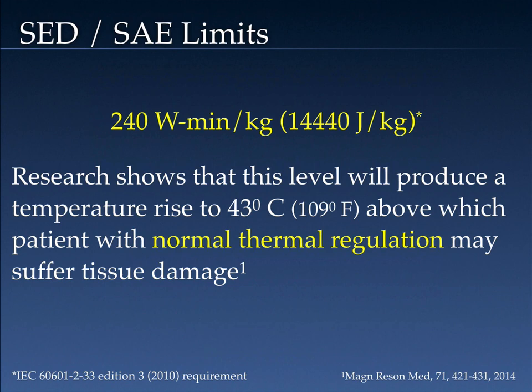So again, this is based on this research, and as I said, I am not aware to date of any published literature which has shown patients having tissue damage due to RF exposure from an MRI exam. Nonetheless, this is an IEC requirement that the system stop scanning this patient at this point. To my understanding of the three vendors that we spoke with at the last RSNA meeting, this means 24 hours. So you would not be able to enter in that same patient ID for a 24-hour period.